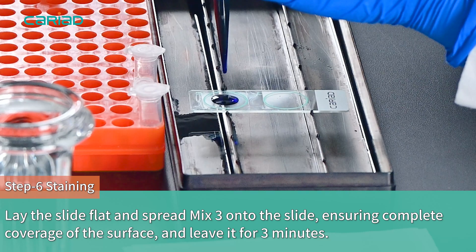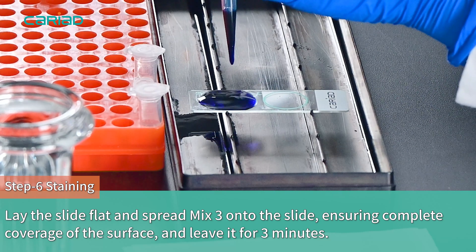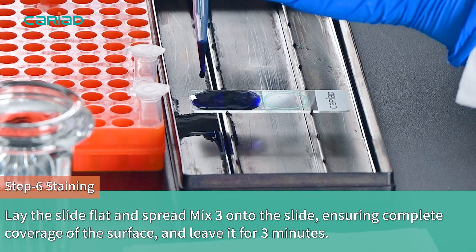Lay the slide flat and spread Mix 3 onto the slide, ensuring complete coverage of the surface, and leave it for 3 minutes.